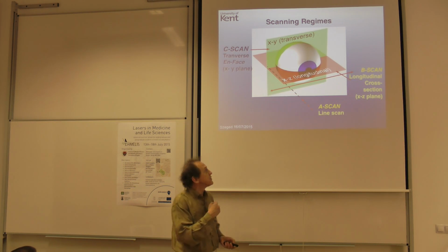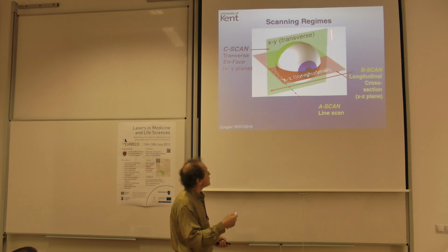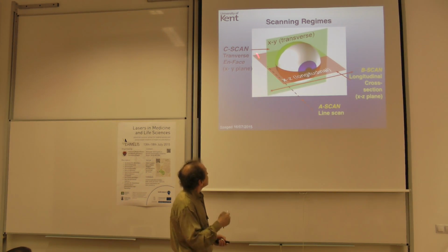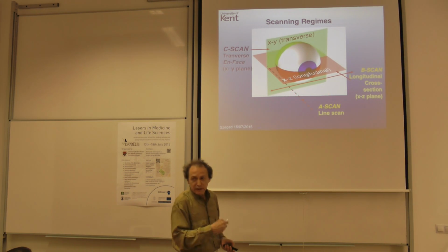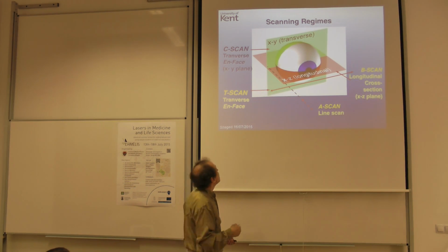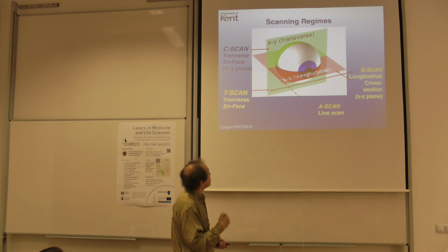In Kent, we insisted on this orientation, inspired by collaboration with the Institute of Ophthalmology in London, Professor Frederick Fitzke, who from the very beginning suggested that we look at OCT doing transversally oriented images like those produced by scanning laser ophthalmoscopes. We call these C-scans, where C stands for constant depth. By doing A-scans, you cannot build a constant depth image immediately. That's one problem of a technology based on A-scans, and I'll come back to that. In Kent, we also introduced another letter on top of A, B, and C, which is T-scans, i.e. when you scan the beam laterally, you produce a transversal reflectivity profile. That is the terminology of scans.